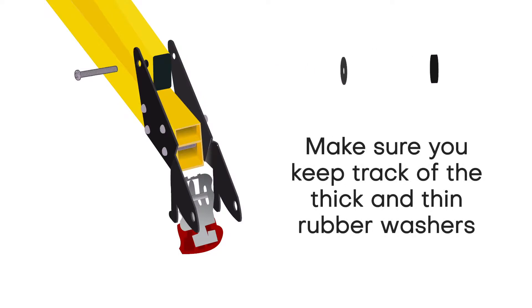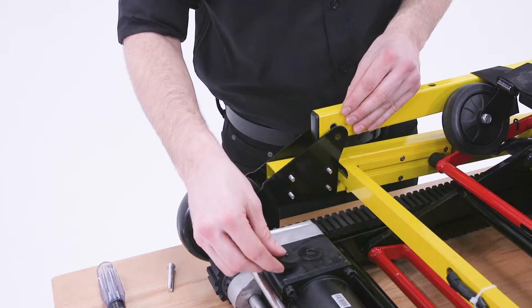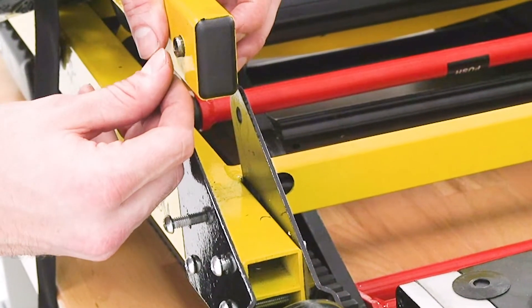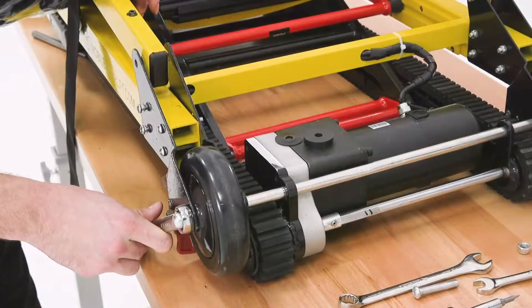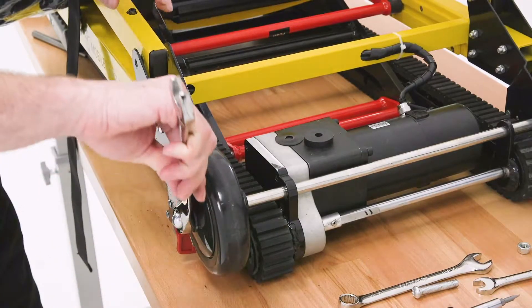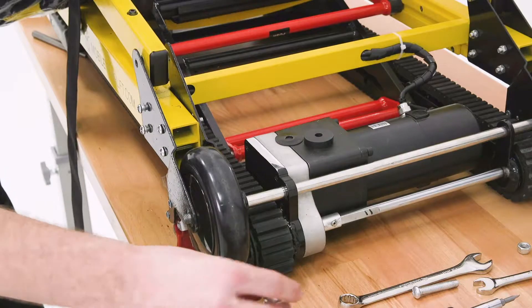When you remove the largest bolt, make sure that you keep track of the thin and thick rubber washers. Additionally, make sure the metal cylinder stays inside the holes on the lever. Next, use the 17mm wrench to loosen and remove the bolt on the axle.